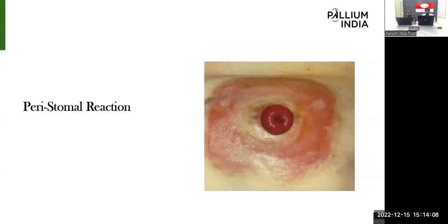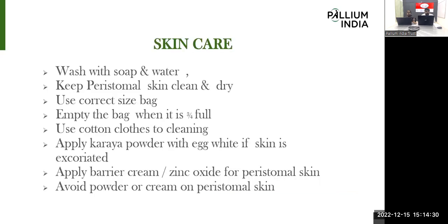This type of peristomal reaction we can avoid by using the proper size of bag and doing skin care, everything we need to do for avoiding the peristomal reaction. If it happens, we need to take some adequate measures. We're going to discuss that in the next slide.